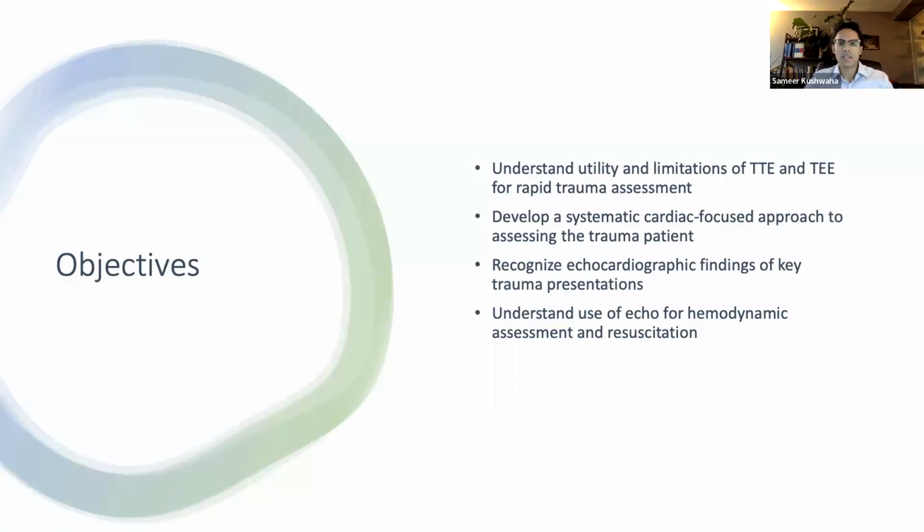So the objectives for this presentation are to understand the utility and limitations of transthoracic and transesophageal echo for the rapid assessment of the trauma patient, to develop a systematic cardiac-focused approach to assessing a trauma patient, to recognize key echo findings of important trauma presentations, and to understand the use of echo for hemodynamic assessment and resuscitation.